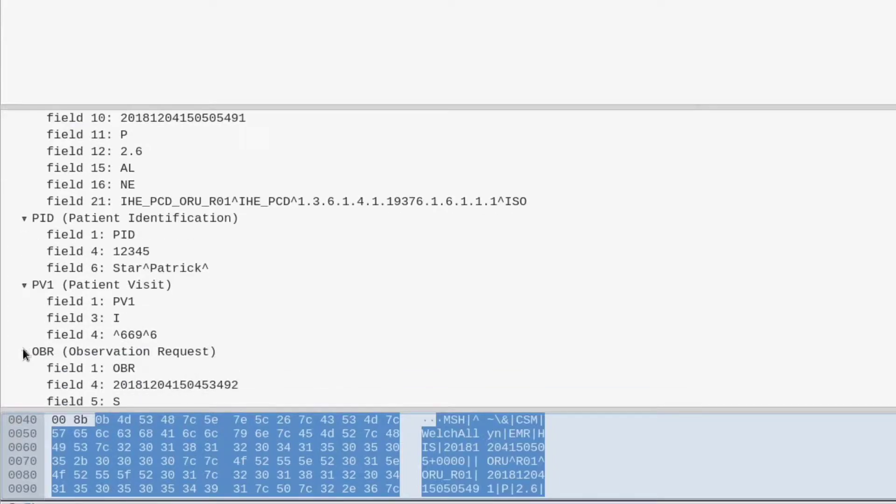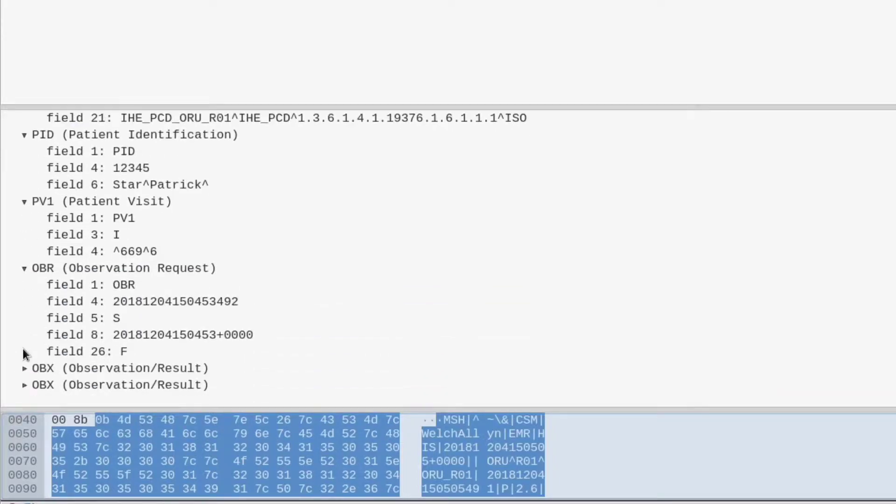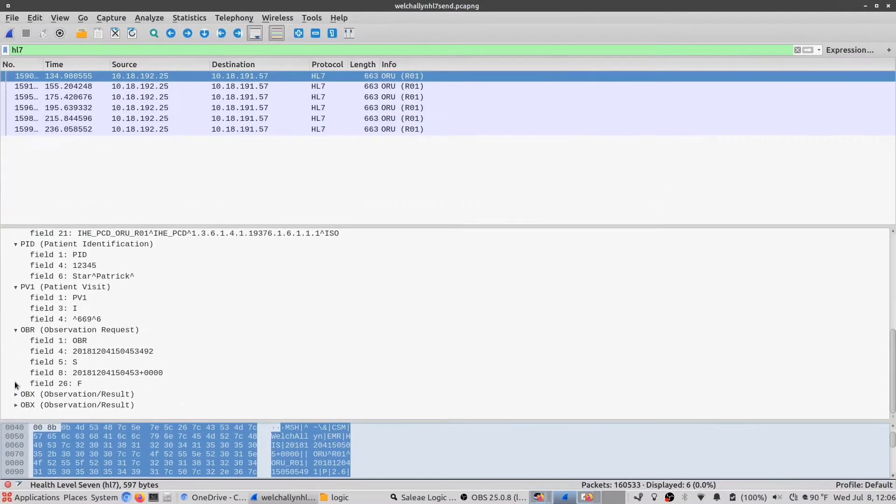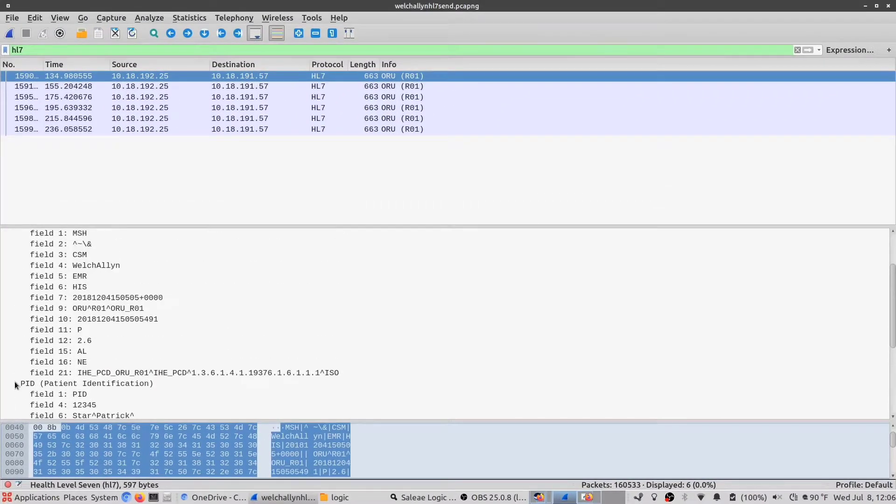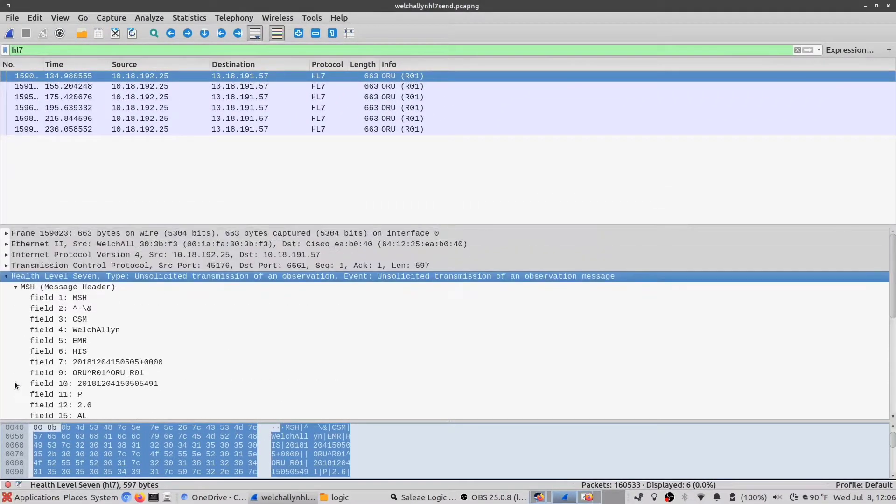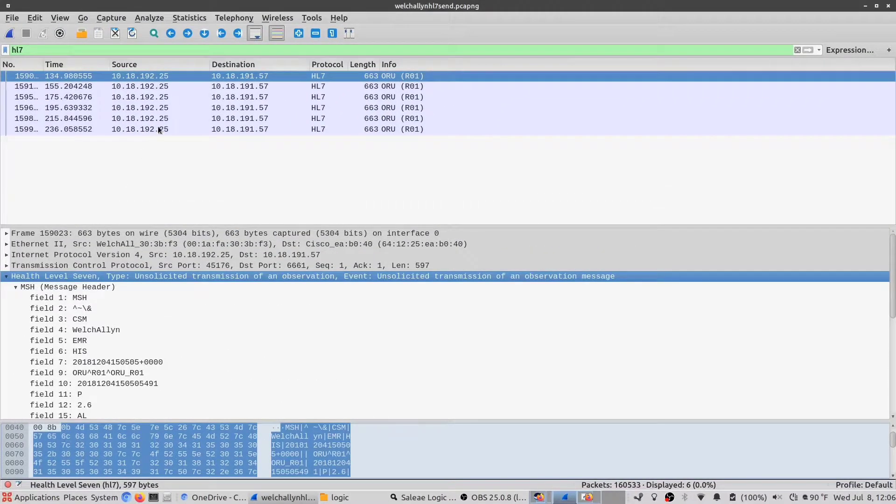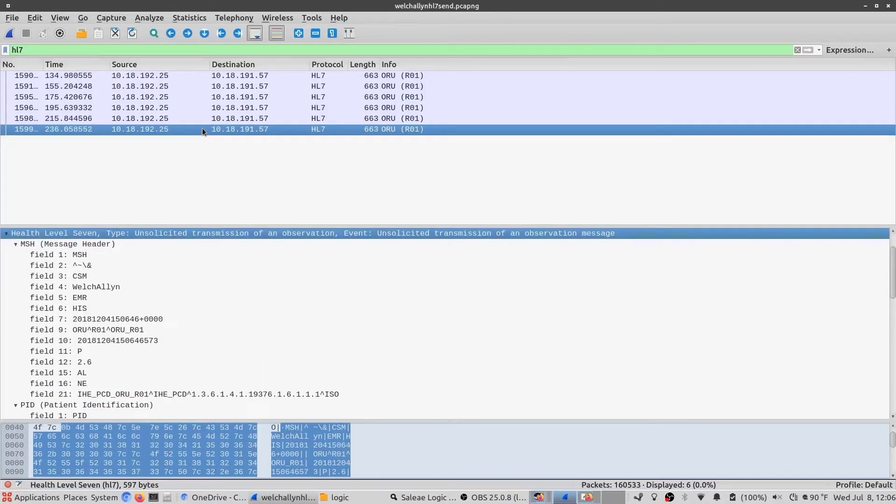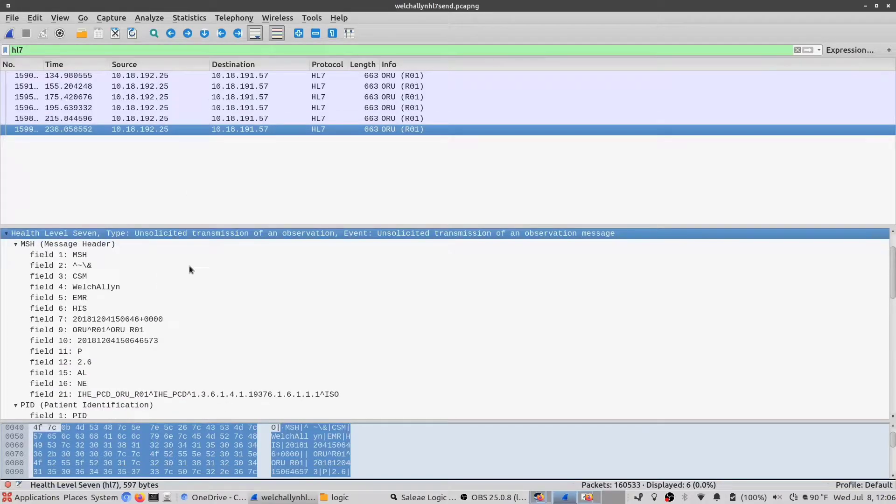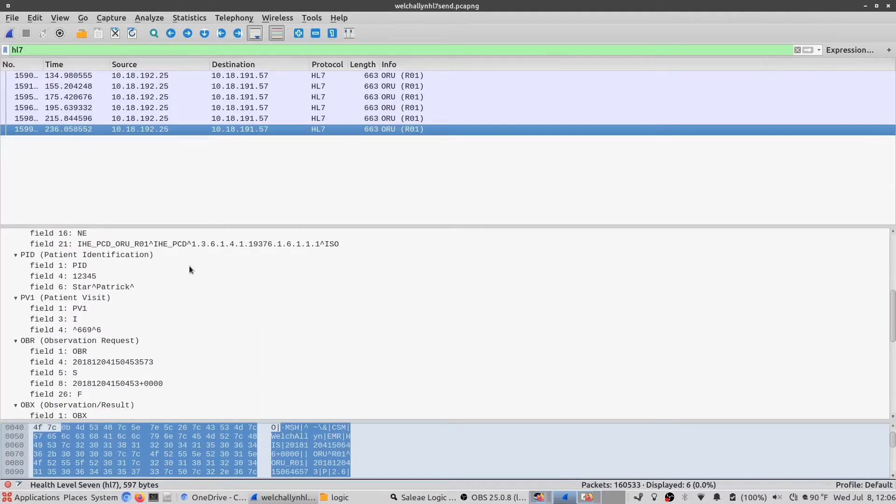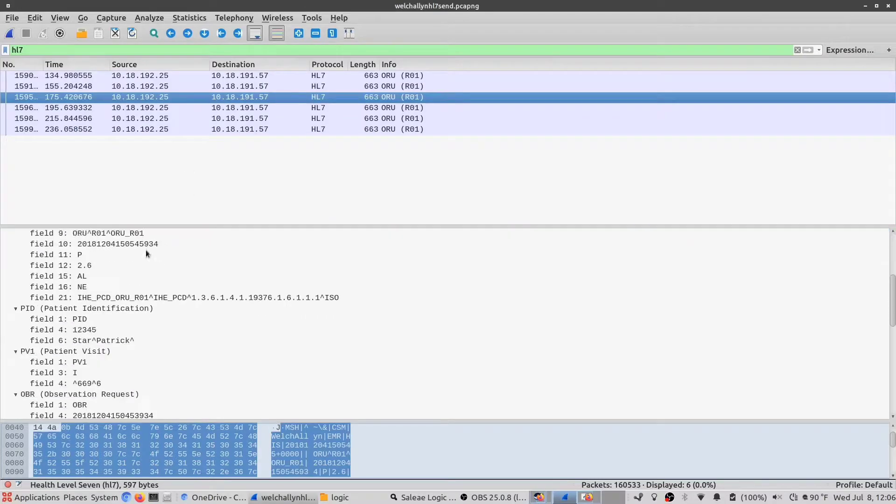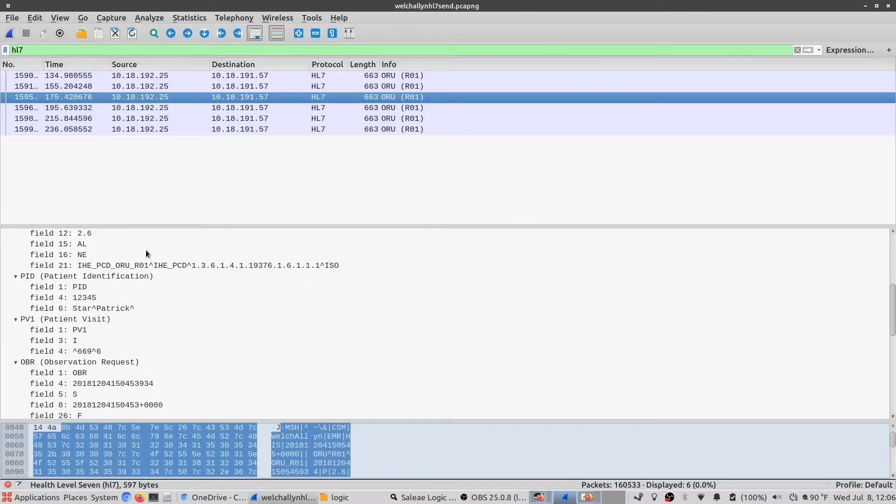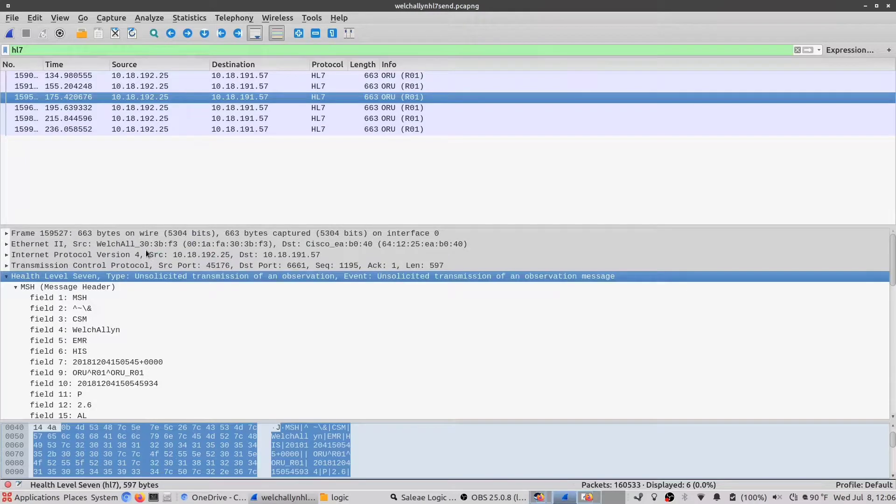One important thing to note is you're able to read all this information, no problem. So that tells us right away that this information has not been encrypted. You could put a tap on a network and watch these packets go through that contain all this patient information, potentially.